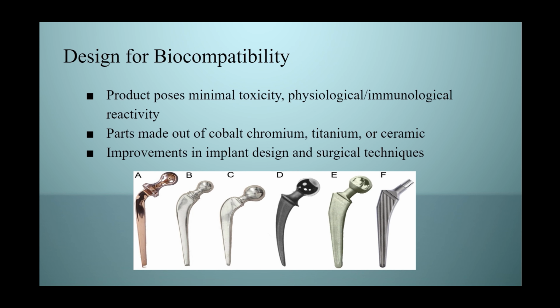Now I'll talk about design for X. First is design for biocompatibility. There are many aspects to consider when we design products, and for hip replacement, one of the most important parts to consider is its biocompatibility.